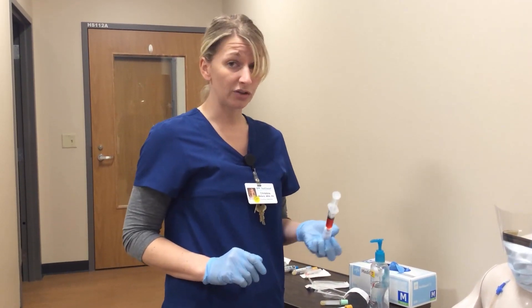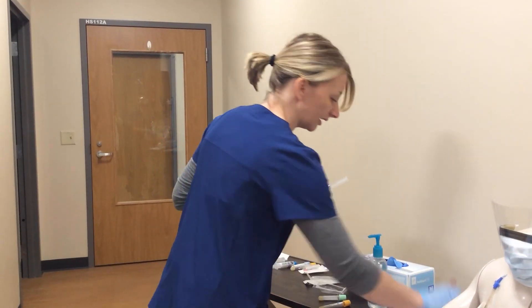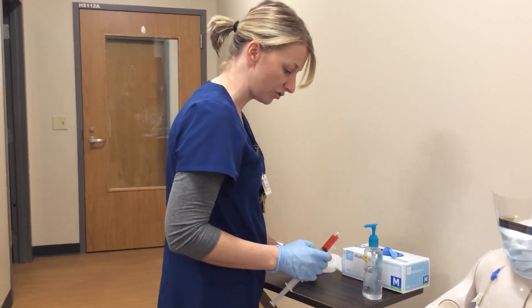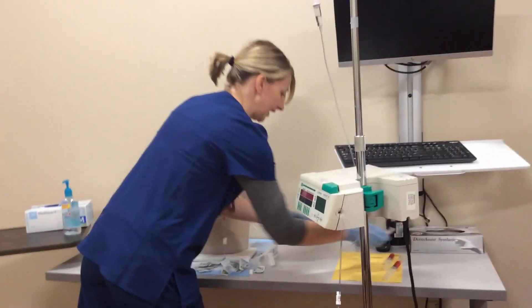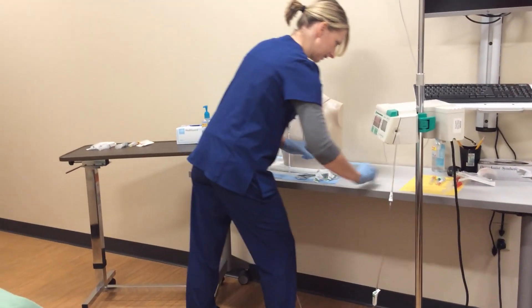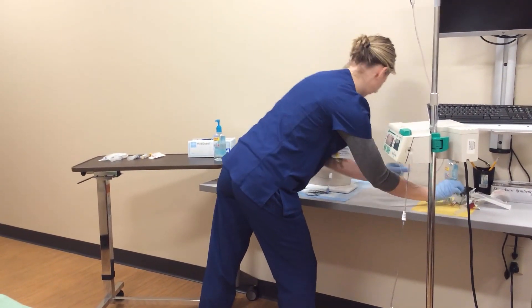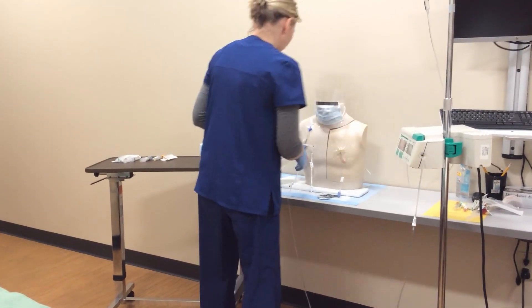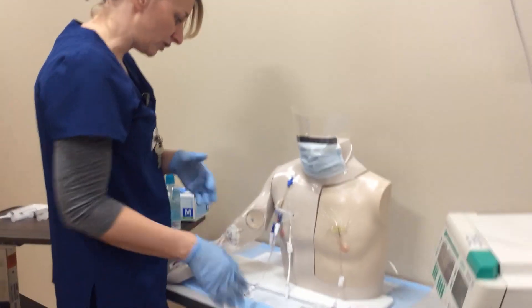That is how you draw blood from a central line when you have an IV infusing. Now I'm going to show you how to draw blood when you have a central line that does not have anything infusing. We can't draw from this port because he's got something infusing that we don't want mixed.